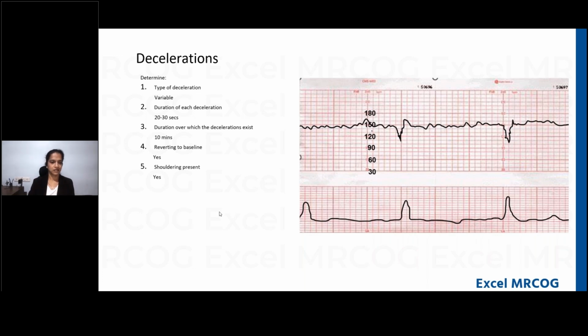So then you have to check if the variability in the deceleration is good. That means if there are these wavy lines in the deceleration, it is a good sign, rather than a smooth deceleration. So that is the other thing that you need to check.